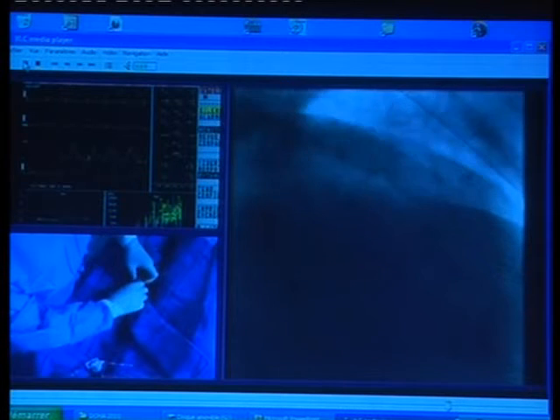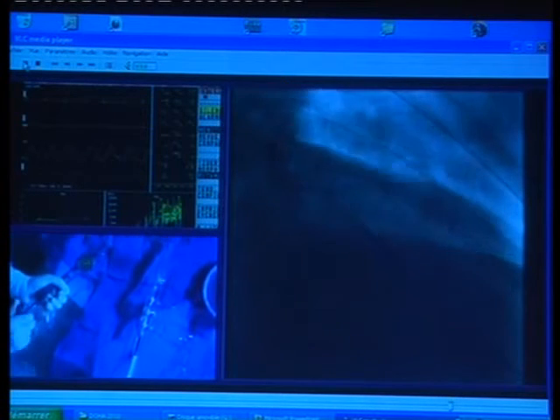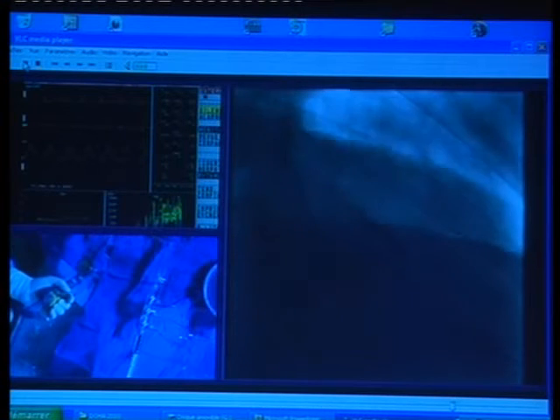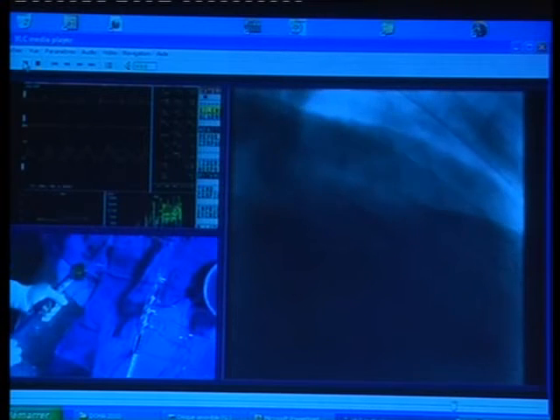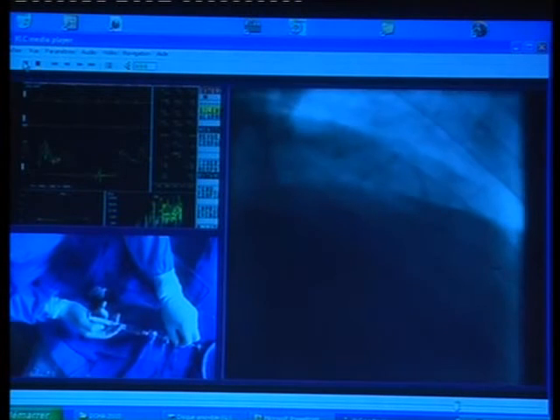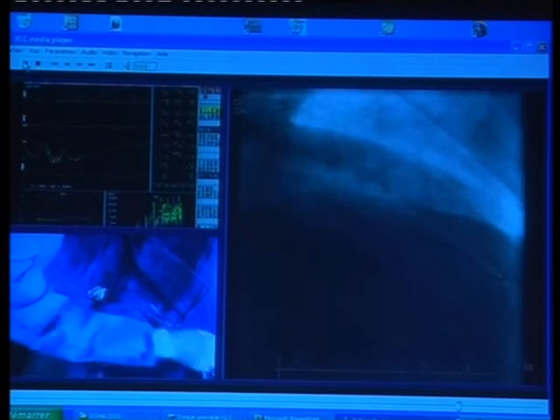Maybe I will do here a little bit more. Okay. Here there is no concern. Turn 20 again? Yeah, 20. It was the part where there was the most severe lesion. Maybe here there is some resistance. Okay, stop. It's time to control. Very nice. It looks very nice.